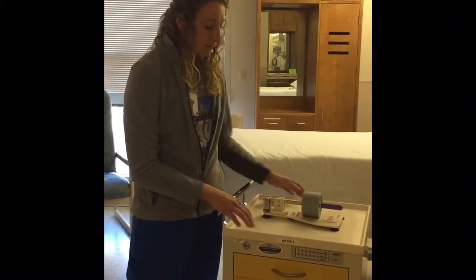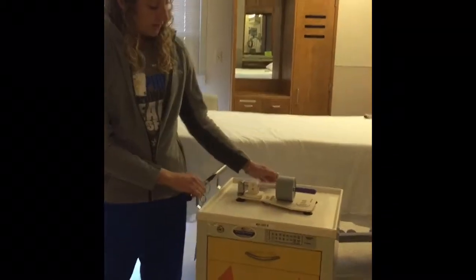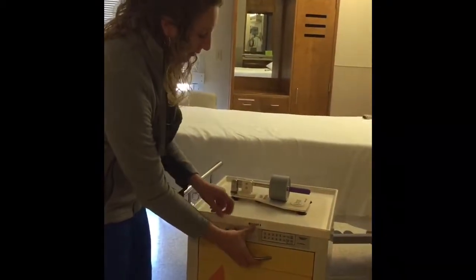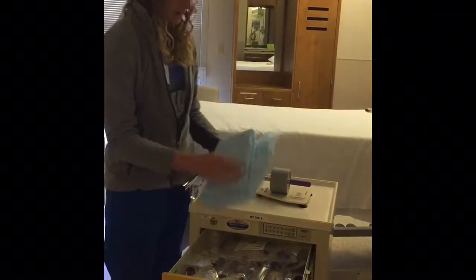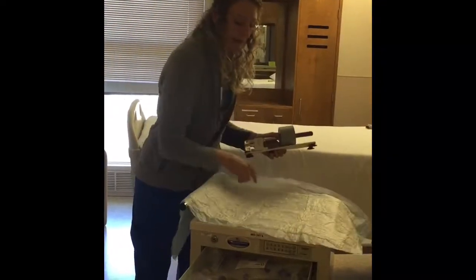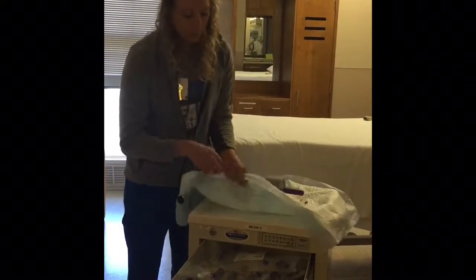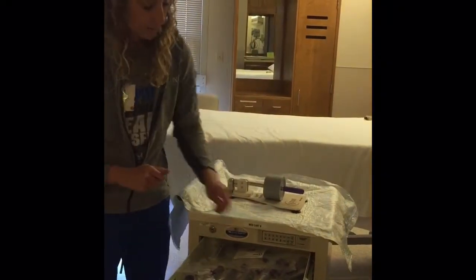So when we're crushing a hazardous medicine, Elkhart General has a crush cart that we're going to use. That crush cart has the RX Crush and then all the supplies you'll need in there. So I take my little crush cart into the room. I'm going to put my plastic-backed chux pad down on the surface. We want to use that plastic one because that's going to help contain any spills.